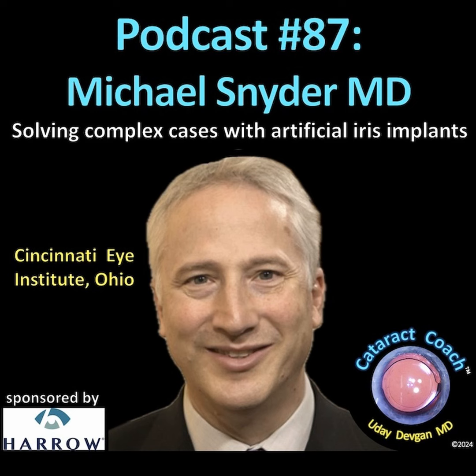It's just super exciting, the technology that people are developing, and I just hope that much of it will eventually land its way here in the US. Yeah, some of it's tough. Like I had a colleague who was discussing an aphakic patient with no capsular support but a normal iris. He said, well, listen, just do the Artisan iris clip lens for aphakia and clip it to the back of the iris and you're done. I'm like, yeah, but we don't have that available in the US.